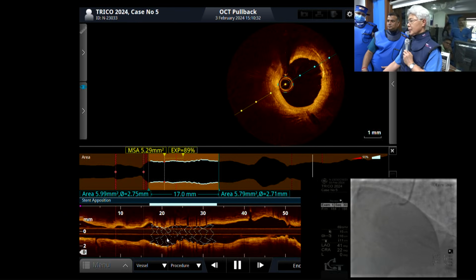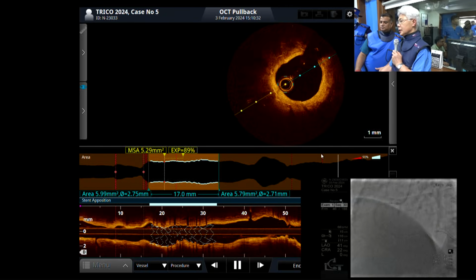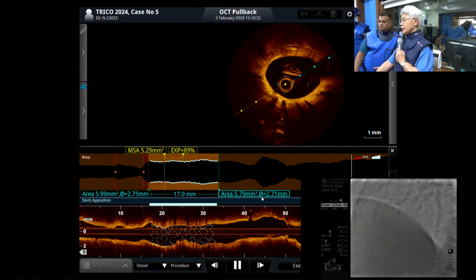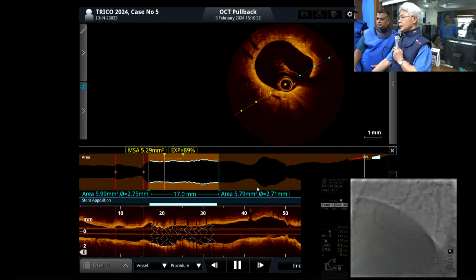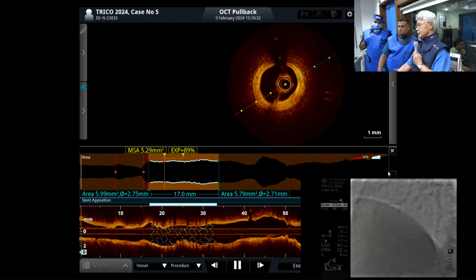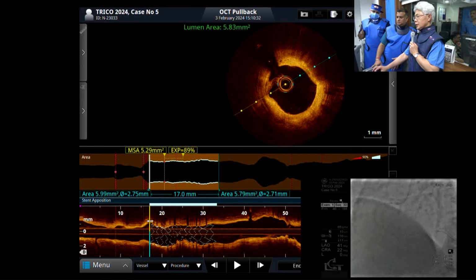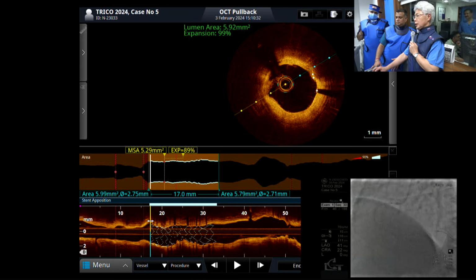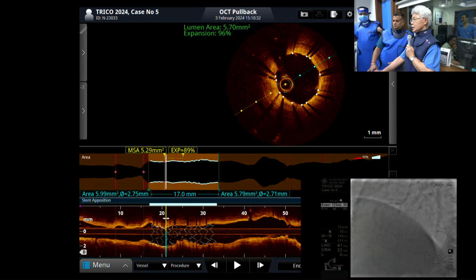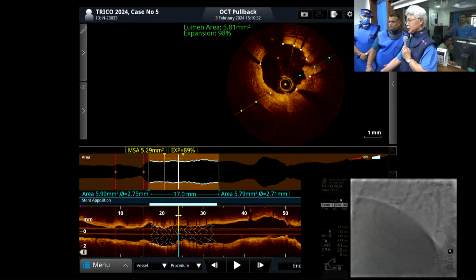And now comes the in-stent restenosis. Looks very good actually. Looks very nice. That's the dye, and the lumen looks beautiful. I think we're done. Distal edge, no dissection, position is okay, right? No tissue protrusion. A small amount of tissue protrusion, it's okay.